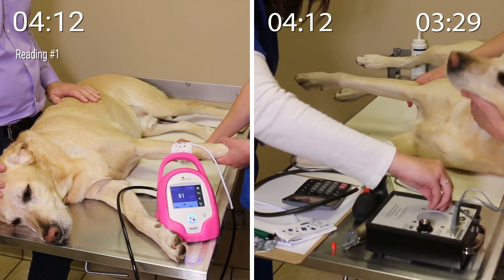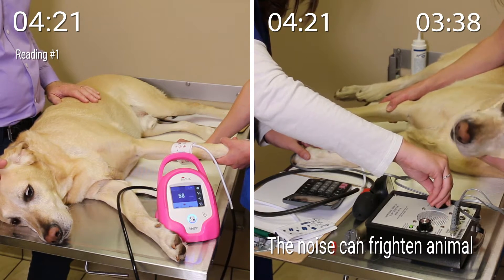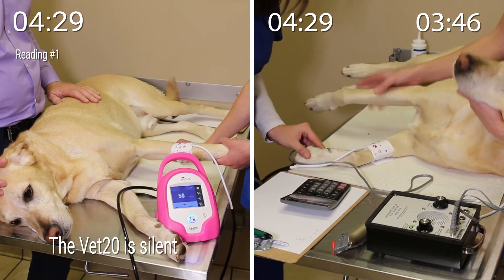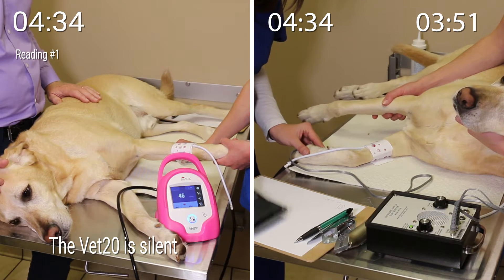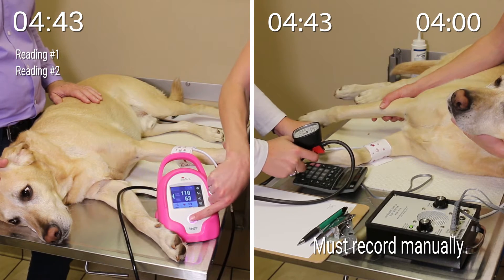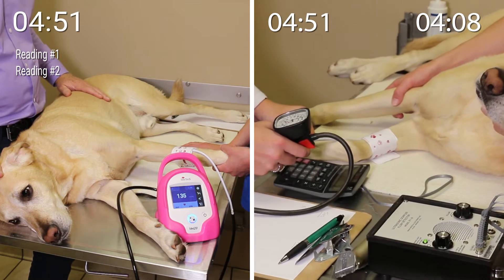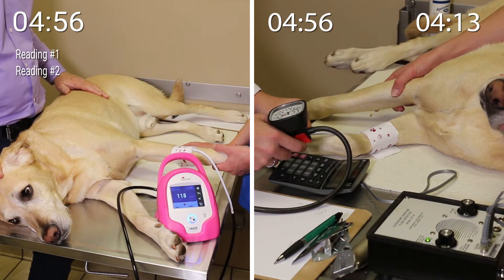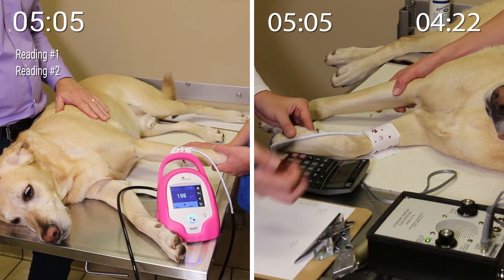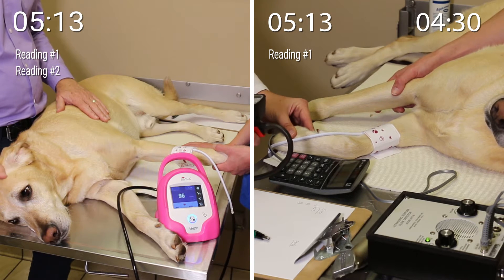The technician will now turn on the Doppler and begin to listen for the sound. The sound can be frightening to the animal, so some technicians prefer to use headphones. The technician is now ready to begin manual cuff inflation. While the other technician holds Tucker still, the first technician inflates the cuff to around 180 mmHg and slowly deflates the cuff while listening to the Doppler sounds. After getting the first reading for systolic pressure, the technician marks the value and repeats the measurement, taking a total of three measurements.